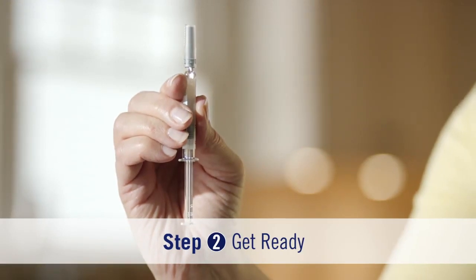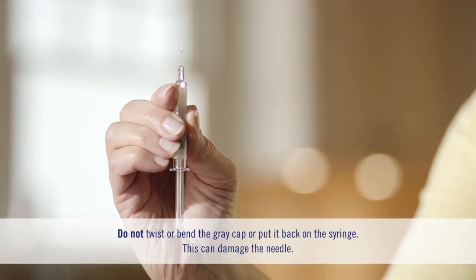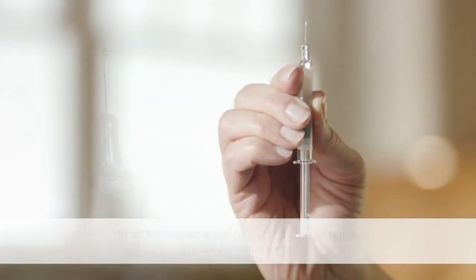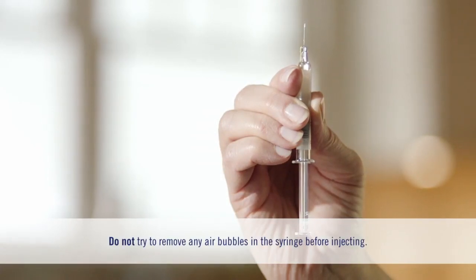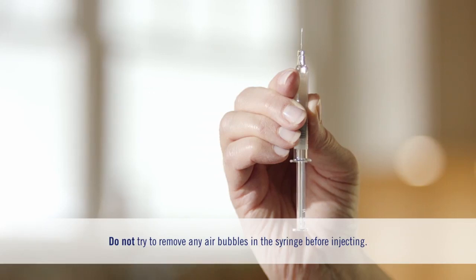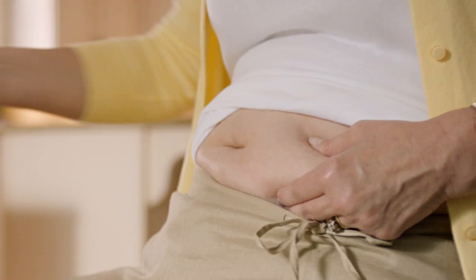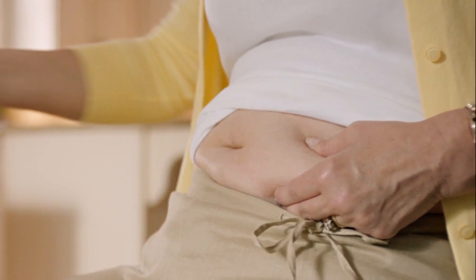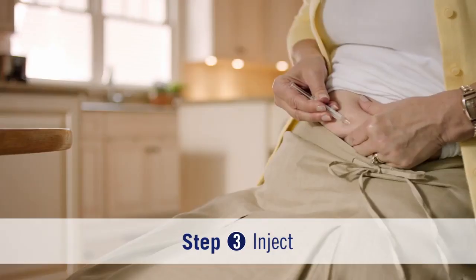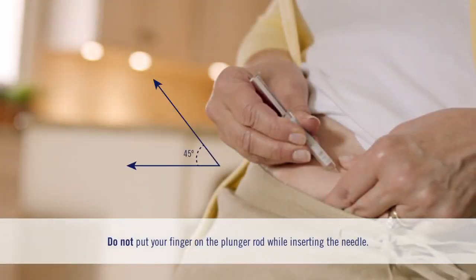Hold the syringe by the barrel and pull the gray cap straight up and off, away from your body, like this. If you see a drop of liquid at the end of the needle, that's okay. Be sure to put the gray cap into your sharps disposal container right away. Now, pinch your skin between your thumb and fingers to create a firm injection surface.